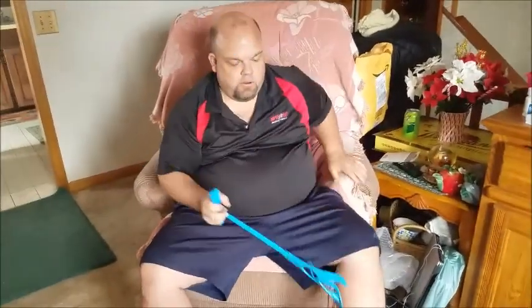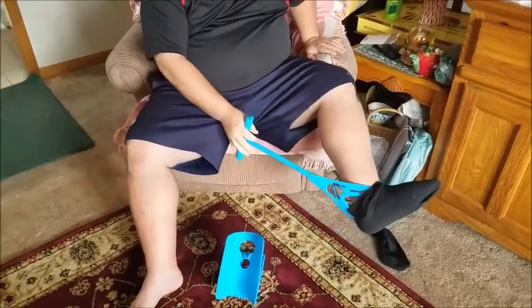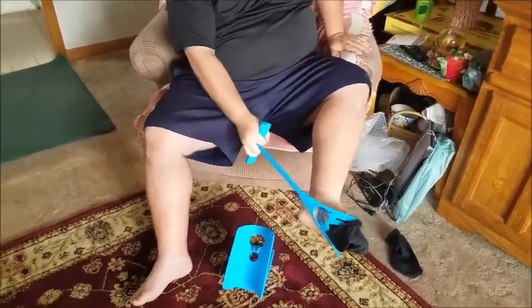You can also use this device to take your shoe off or your sock off. So you can just pry it down here and pull it off.